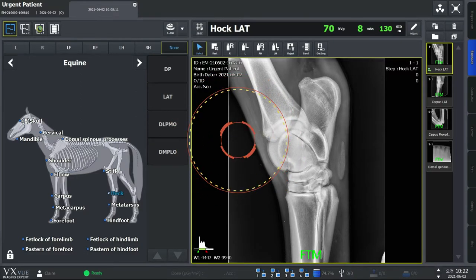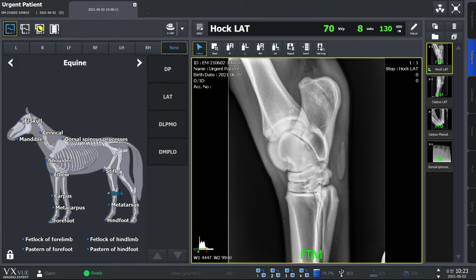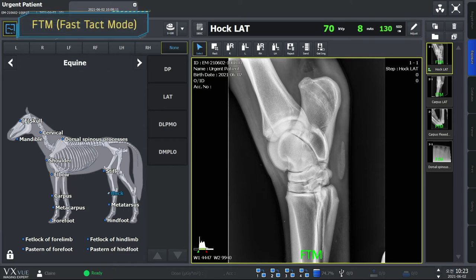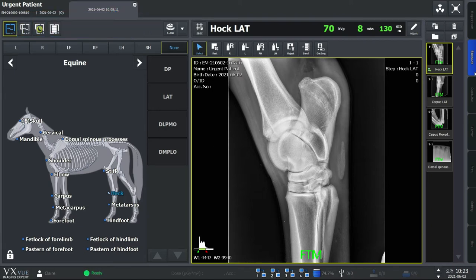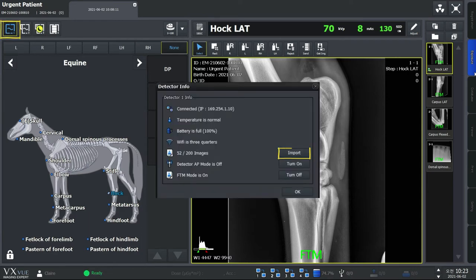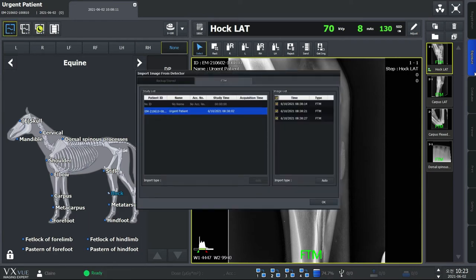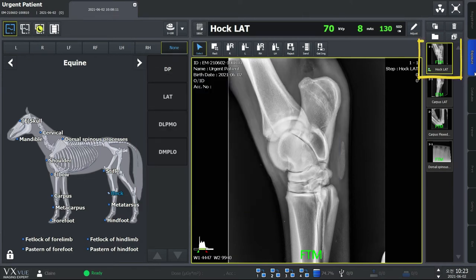We have a separate equine-only mode to make your workload more efficient. When working with horses, speed is key. VXVue's FTM, or Fast Tech Mode, makes taking dozens of extra images of a horse less tiring for both the people and the horse. Simply put, FTM allows you to check the preview images from the viewer. You can check whether to approve or reject a study from a preview image before the full image is transmitted to the viewer. You can import the full image when you want by pressing the import button or clicking the preview thumbnail image.